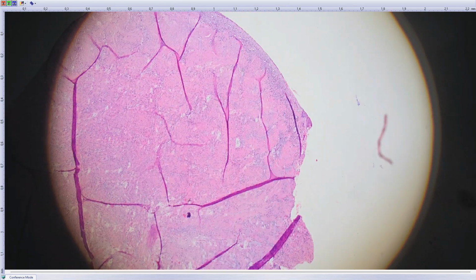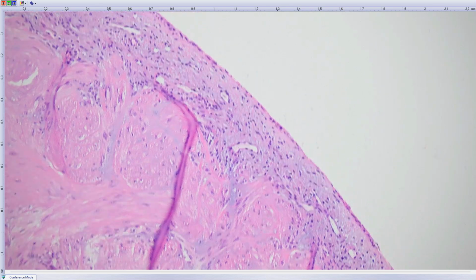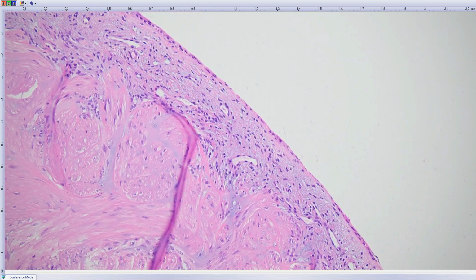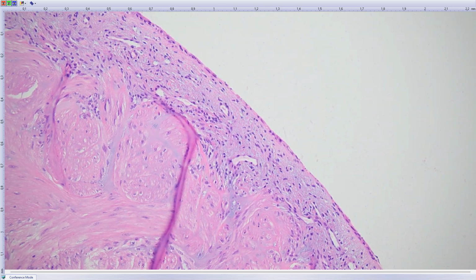But the important thing is to notice the population outside of these smooth muscle bundles. It was better visible in this first slide. For example, here at the periphery, you see these darker cells with less eosinophilic cytoplasm. Try to show the arrow. It doesn't seem to work.